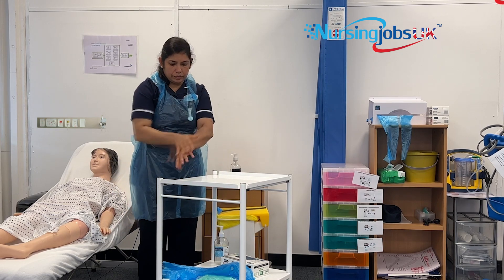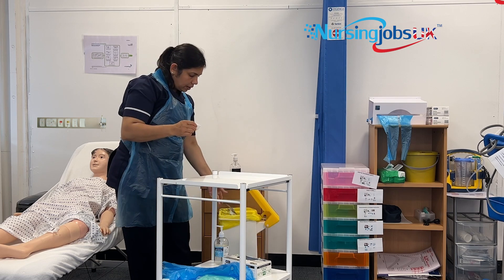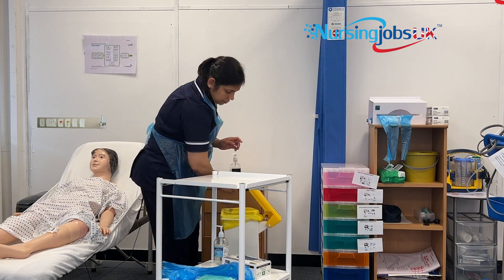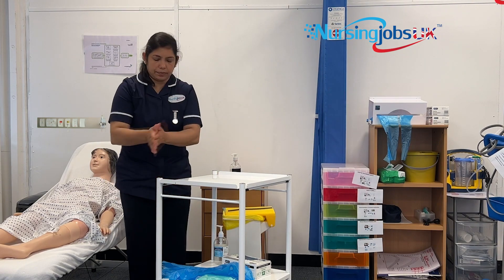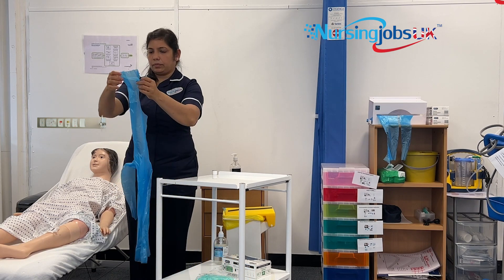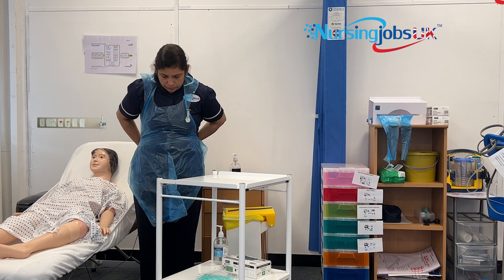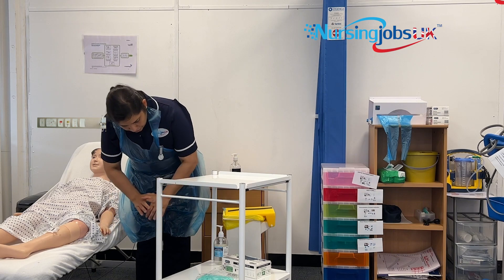Leave the loosened dressing there for now, remove your gloves, and gel your hands again. Now clean the top of the trolley with the chlorhexidine wipes. If needed, remove your apron here and put on a new one. Wait 30 seconds for the trolley surface to dry — my trolley is 30 seconds, so it's now dry.